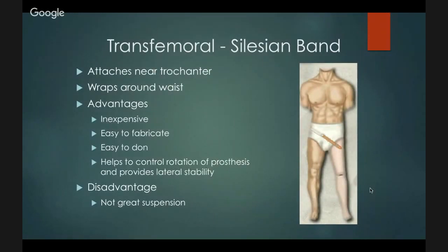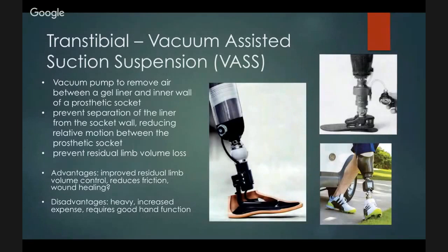Do you ever find that it's overly sucking on the leg and it's causing like edema or something? Well, I mean, the idea is that not necessarily edema, but it increases the residual limb volume size. There was something else I forgot to mention, but yeah, I have had a patient or two that's complained of pain, and so we actually just cut off the thing and just changed it to a regular passive system.